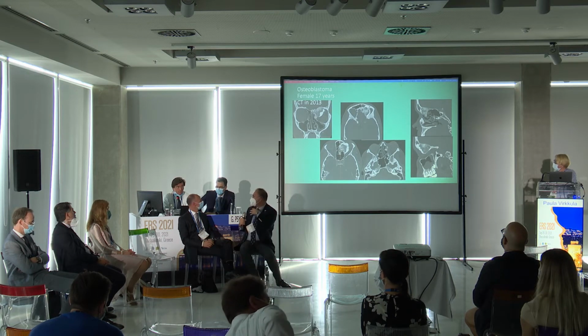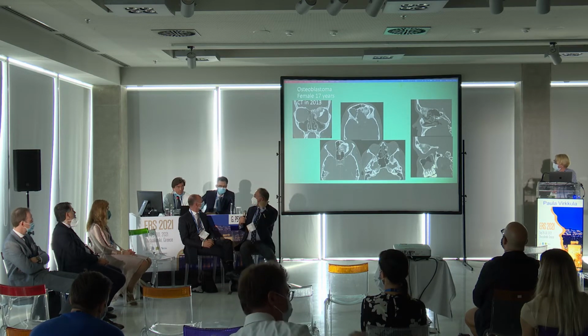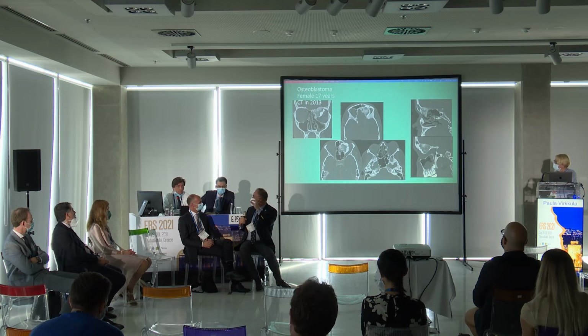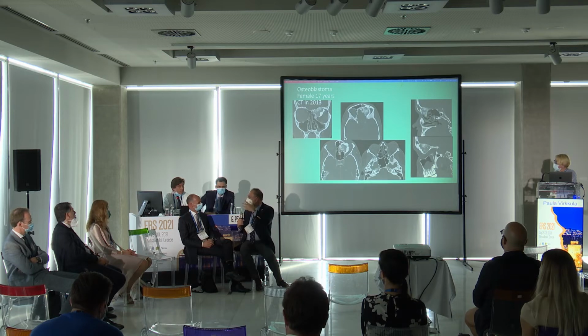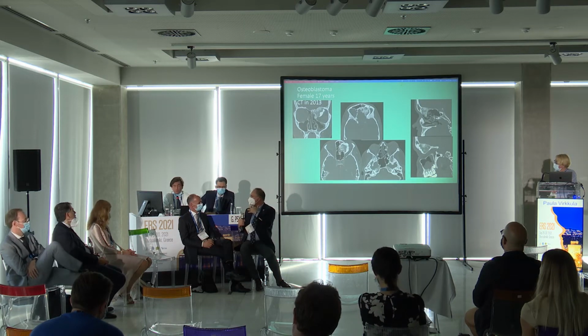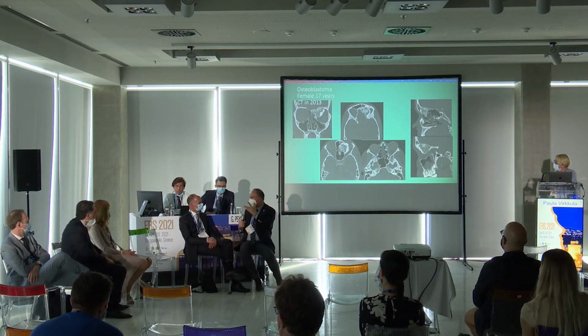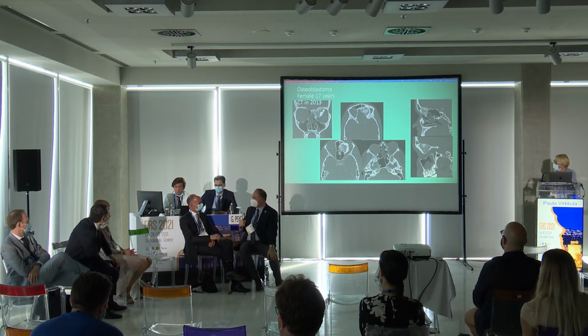And if I operate today, I would use the navigation system and I would mark its trace. And even we have the augmented reality possibility. So when I'm coming nearby, it already shows within the tumor where it is. And then, you can bipolar and ligate it.